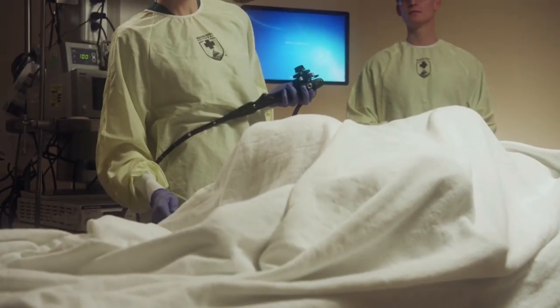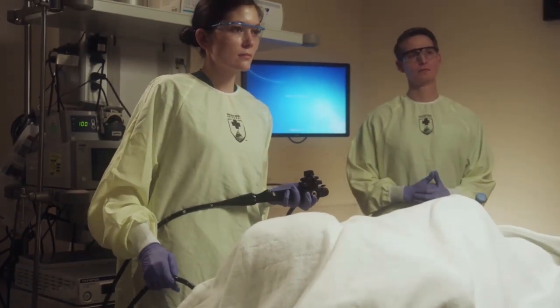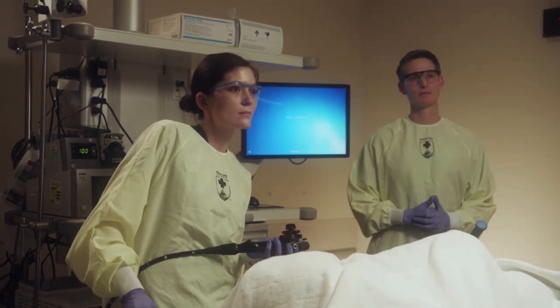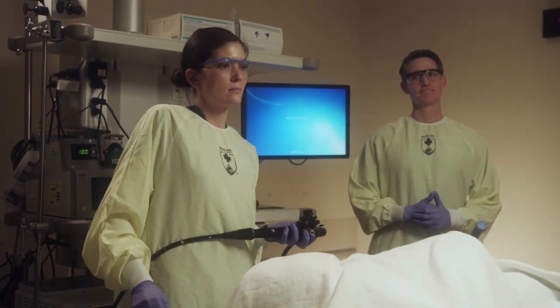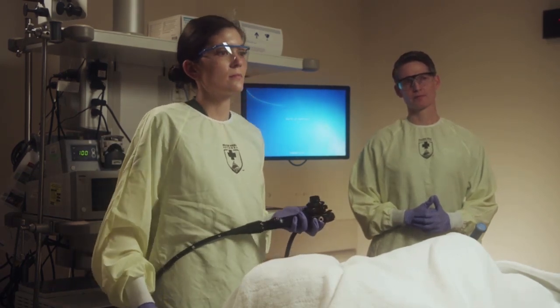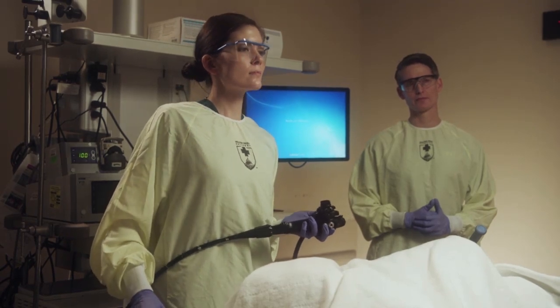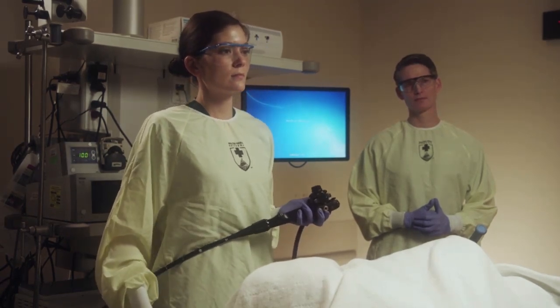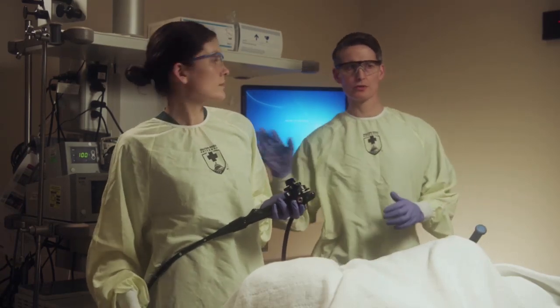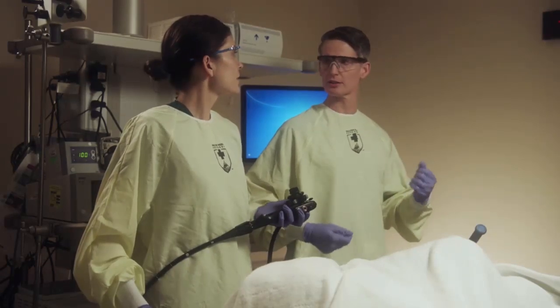While many transformations must take place in your development as an endoscopist, it is not necessary that you transform yourself into the scope. Personification, or 'becoming the scope,' is subconsciously used to coax the scope into going where you want, and this is a common phenomenon during training. While this is a positive cognitive sign, it can lead to holding awkward positions which have no positive effect on procedural outcome. Your staff will likely notice and correct these postures, but foreknowledge of them will hopefully help you recognize and modify them too.